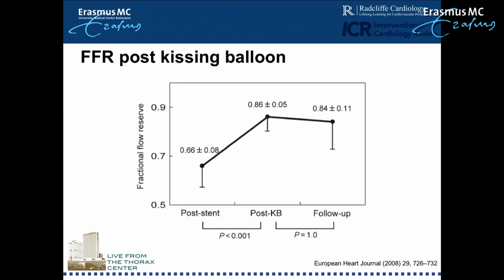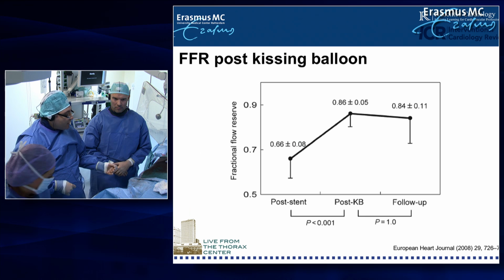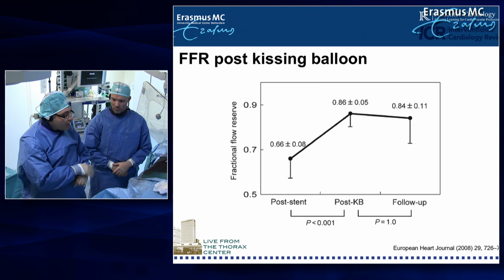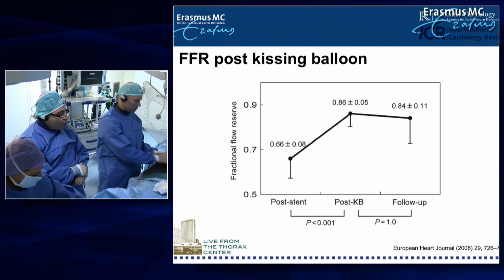We have here a slide where we can see that at 6 months follow-up after performing kissing balloon in side branch with a disease in the ostium and pinching of the ostium after stenting, they maintain the good FFR values over time.